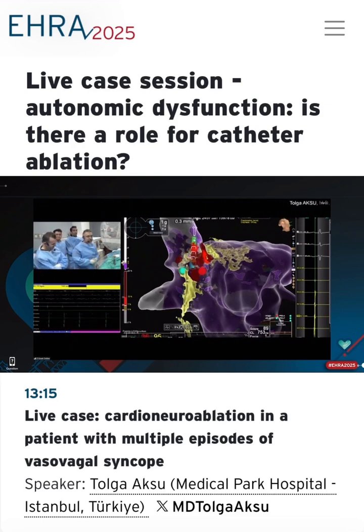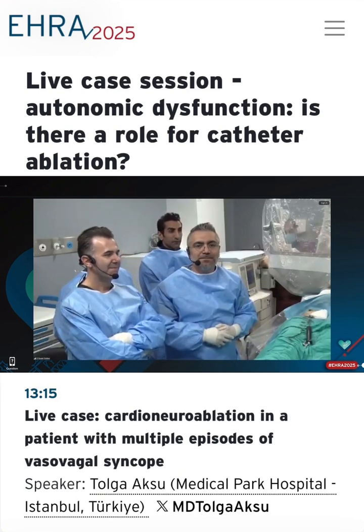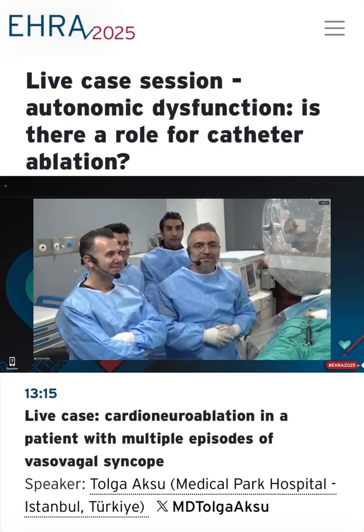Yeah, fantastic. Thank you very much for taking us through this elegant procedure in almost no time. How long did it take you? This is not a routine procedure, of course, but it's a live case. So half an hour, is this your regular time that you need for such procedures? Yeah, very elegant. Thank you again.